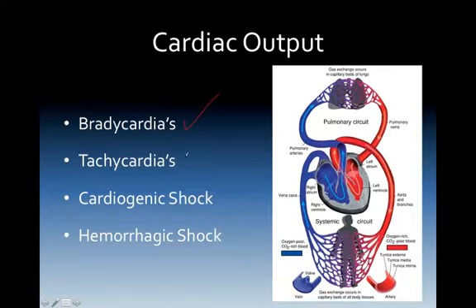So tachycardias, are they tolerating it well, or are they not? In cardiogenic shock, are they going into pump failure or not? And in hemorrhagic shock, are my fluid boluses effective or not?